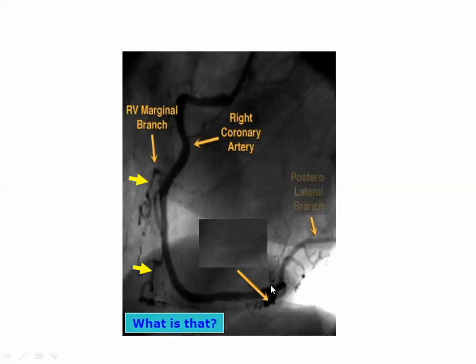PDA? Yes, and this is the PL. Okay? This is a posterior descending and this is the PL. Okay?